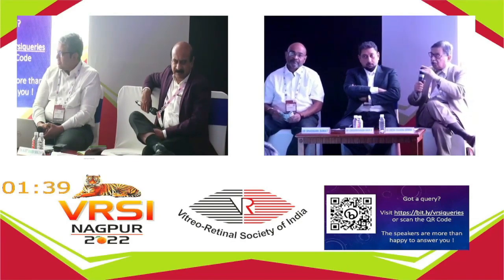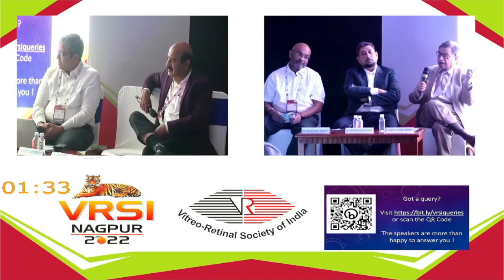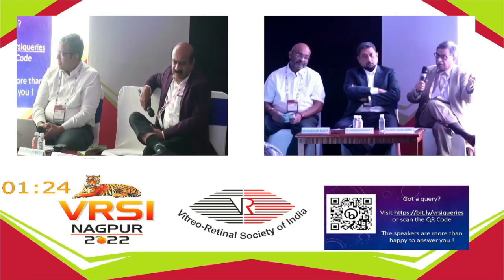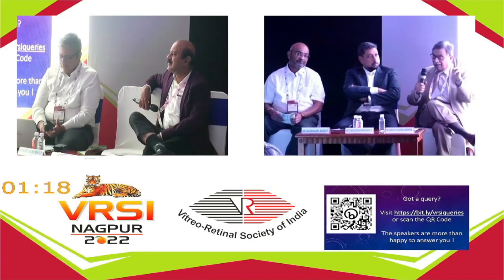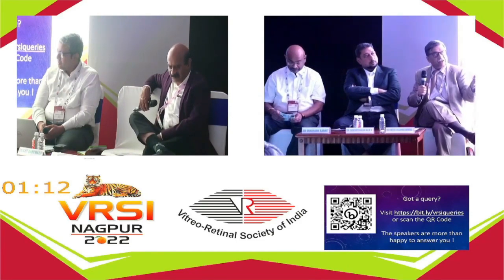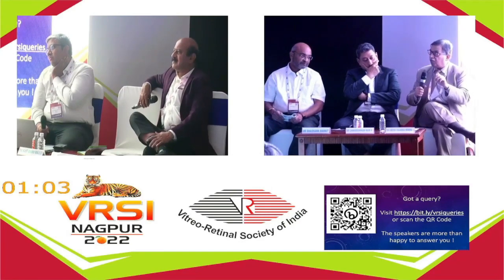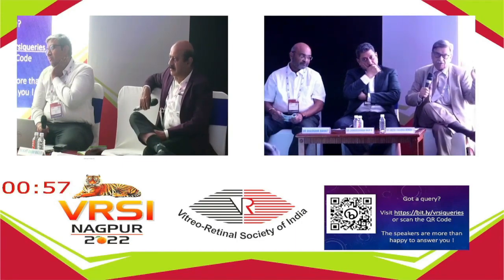The problem comes in the transition. When persons move from an old machine to a newer machine and continue to use older paradigms, they actually take all the disadvantages of the new machine. They don't get the advantages. And when you're doing it with a new machine and then you suddenly go to an old machine, without realizing that now you've gone to an older machine, you have to bring yourself back and think, now how does this paradigm change for management? Whether it's valve cannulas, cutting rates, or infusion bottle heights, everything changes depending on the machine you are using. And the important thing is, you are safe with any machine, provided the man behind the machine thought over every aspect of the system.